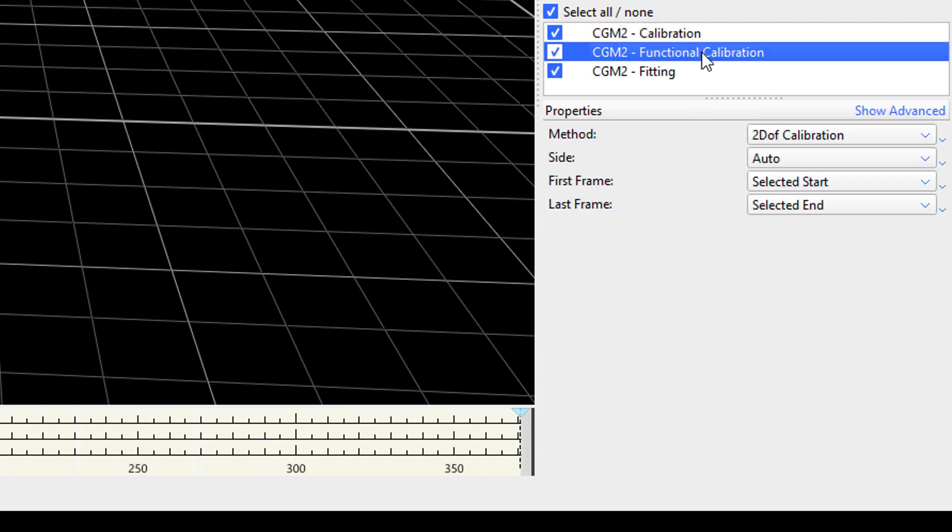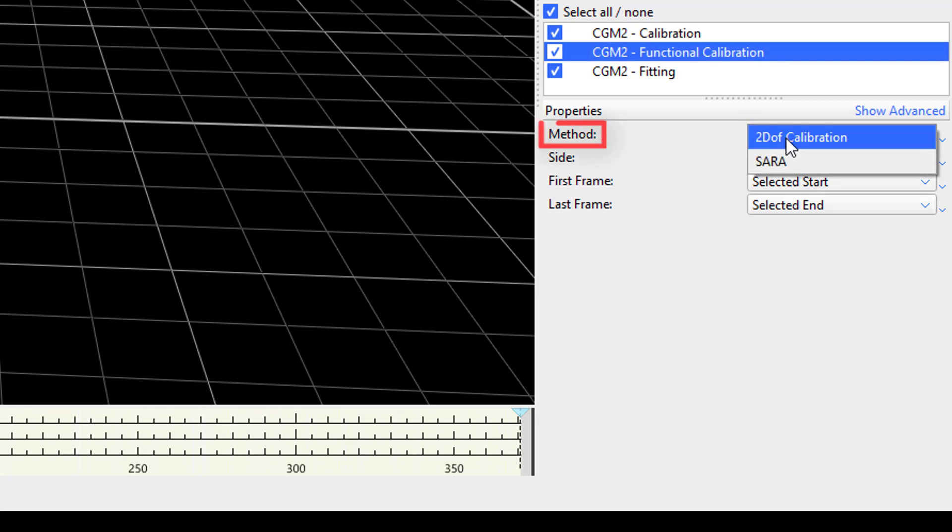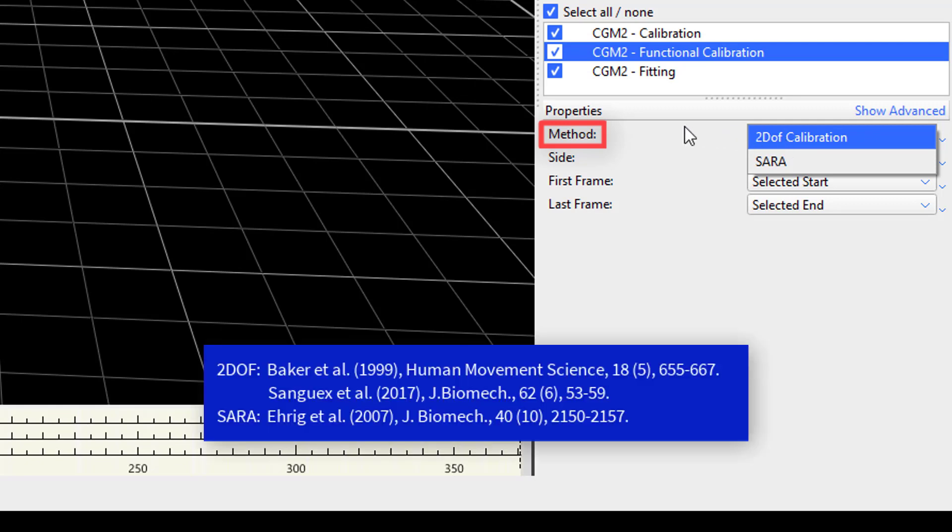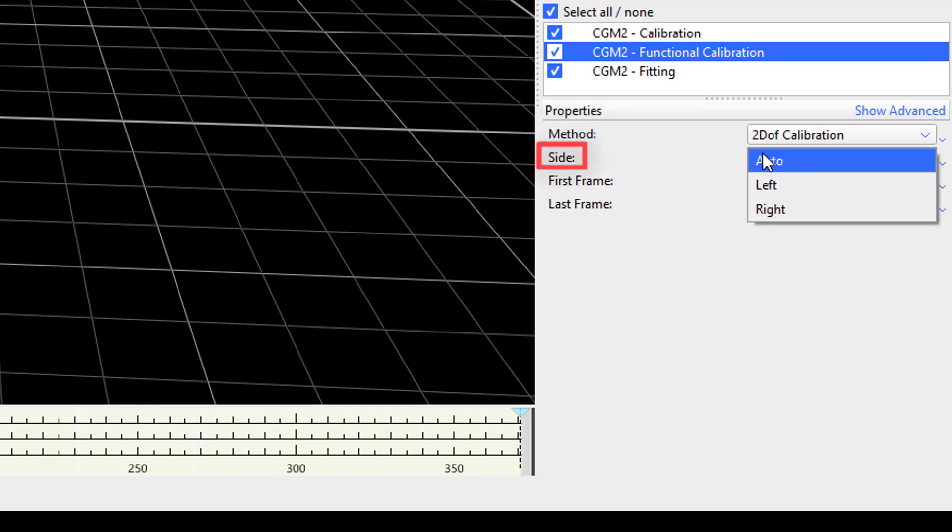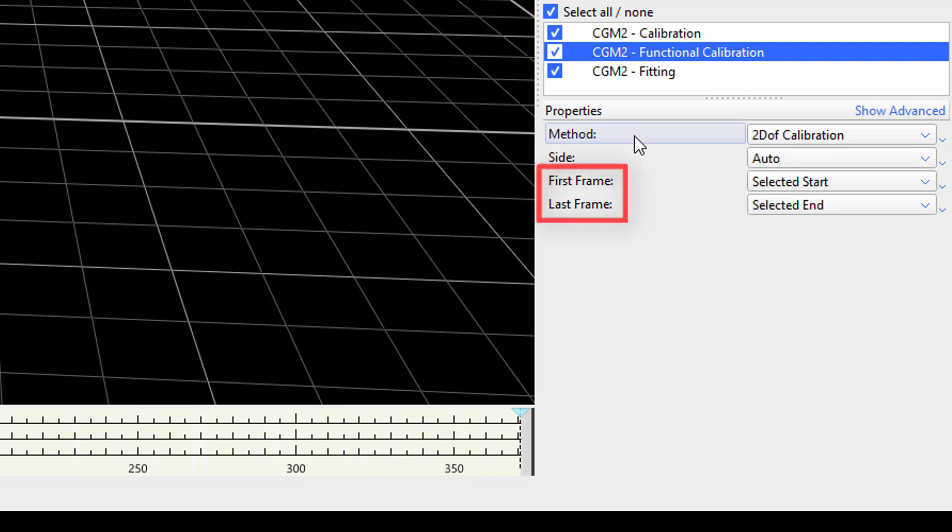CGM2 functional calibration should only be used when running the CGM2.6 which is the knee calibration model. The first property lets you select whether you would like to use the 2 degree of freedom or the SARA method for calibrating the knee axis. References for both of these methods are shown below. The next property allows you to set which of the sides you would like to process. If it is set to auto, the algorithms will detect the side based off of the ankle marker movement. The last two properties allow you to specify the range over which you would like to run the functional calibration.